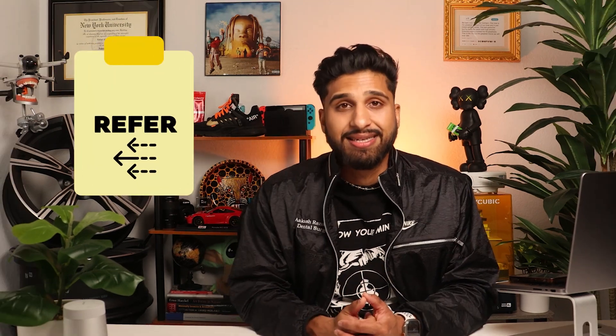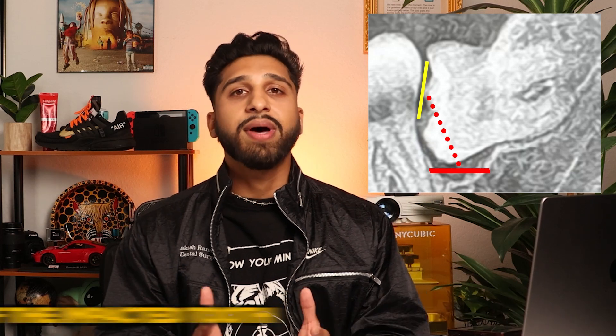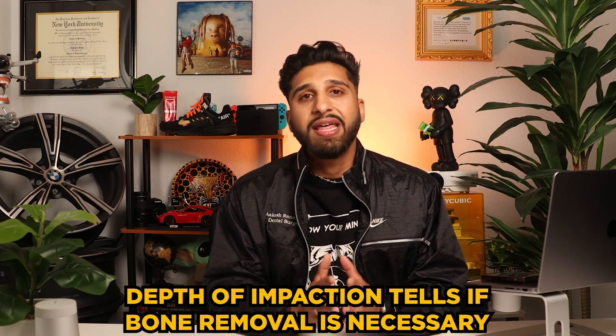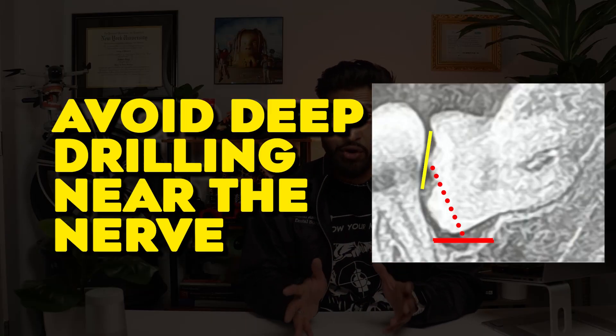I personally know my skill level, and if there's a really deep impaction, I'm the first one to grab that referral pad and send the patient to the oral surgeon. Furthermore, I evaluate the depth of the mesial impaction, examining the distance between the mesial aspect of the impacted tooth and the adjacent tooth. This helps me identify a suitable location for placing the elevators and guides me in determining the amount of bone that may need to be removed and whether or not to section the tooth. If the mesial impaction is in close proximity to the nerve, I'm referring out to avoid deep drilling near the nerve.